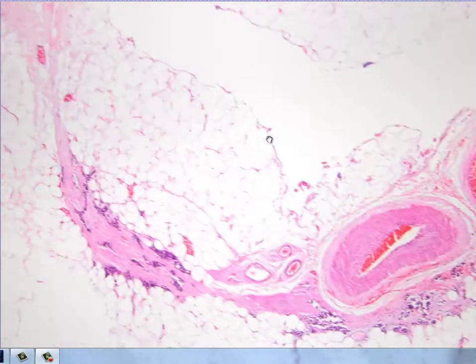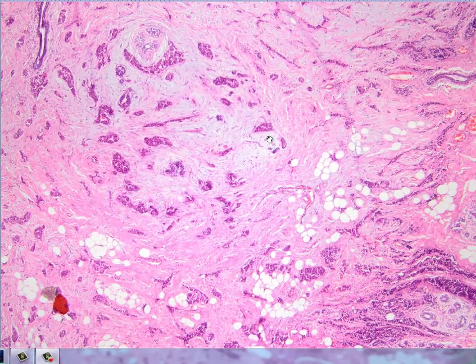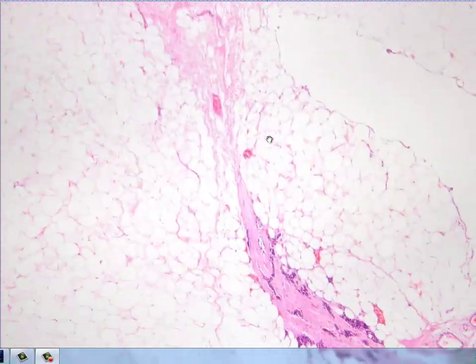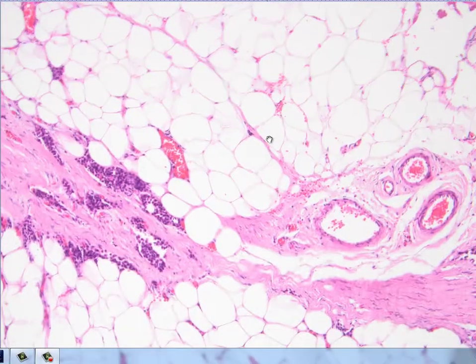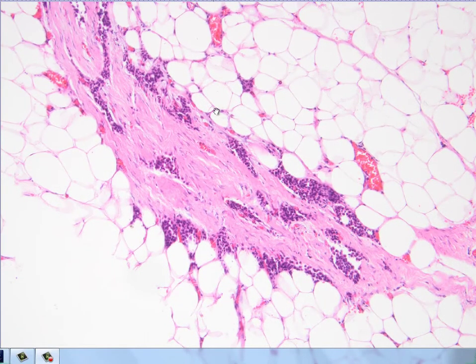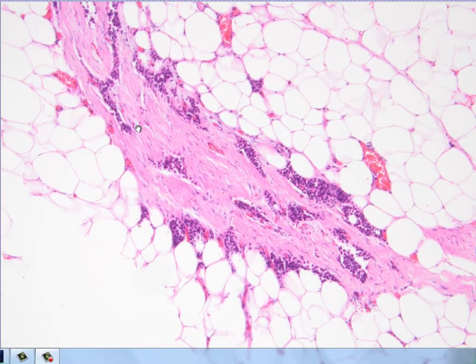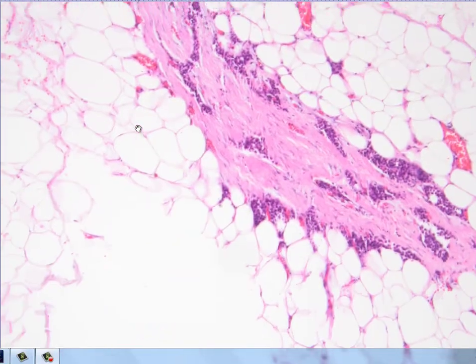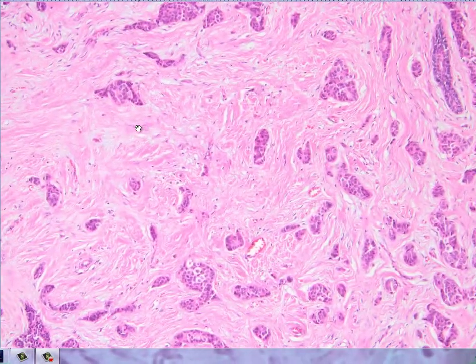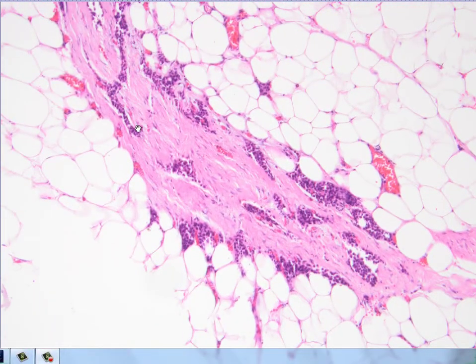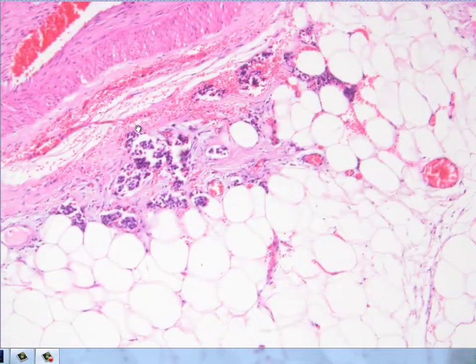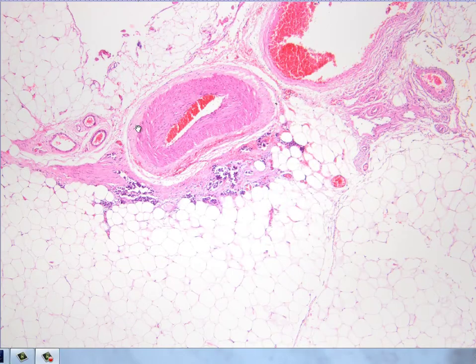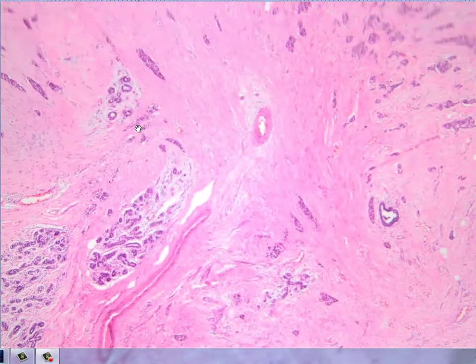Then I realized that these tumor cells are accompanied by a myofibroblastic proliferation that looks different from the desmoplasia of the tumor itself — it is more young, younger myofibroblasts here.